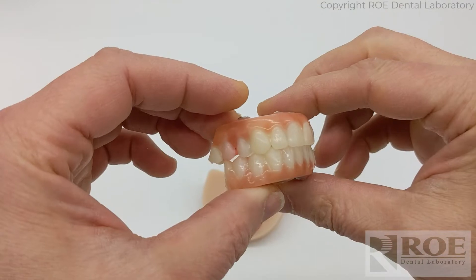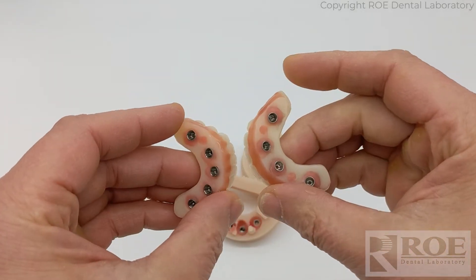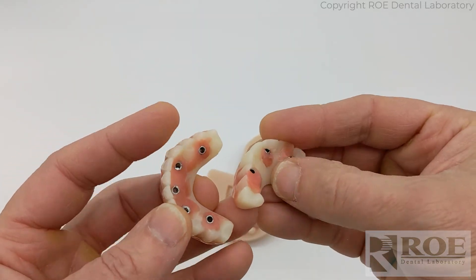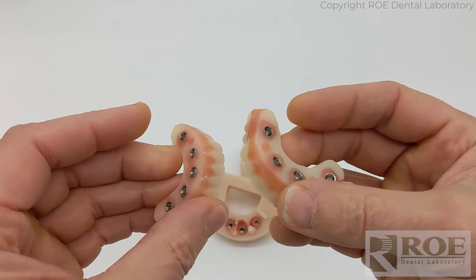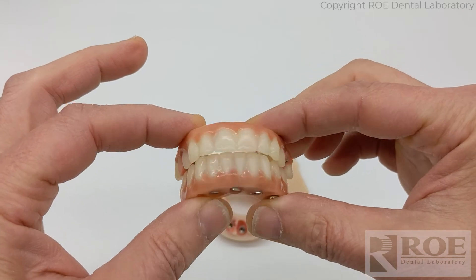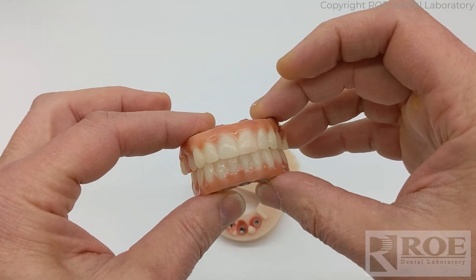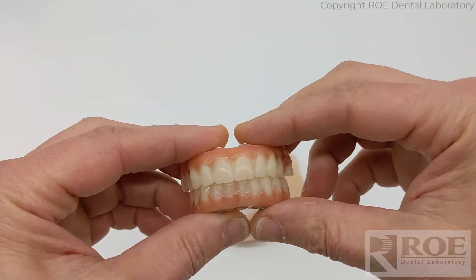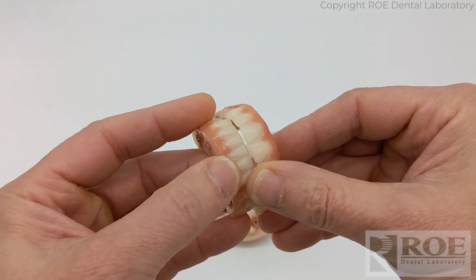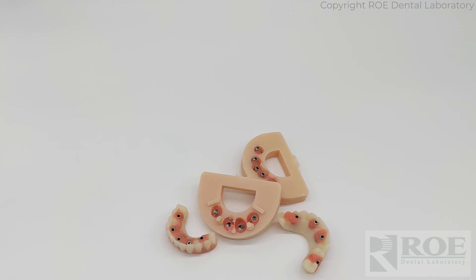In about 15 minutes we converted this rapid appliance that was pretty rough into something that's wearable. Is it perfect? No. But it is smooth, it's polished, it'll be nice to the tongue, the holes are filled, and it'll look beautiful. These were always monolithic and now they're really aesthetic and comfortable enough while the take-home prosthetics are sent to us with the worked-in bite, so we can either go direct to final or go to printed try-ins.